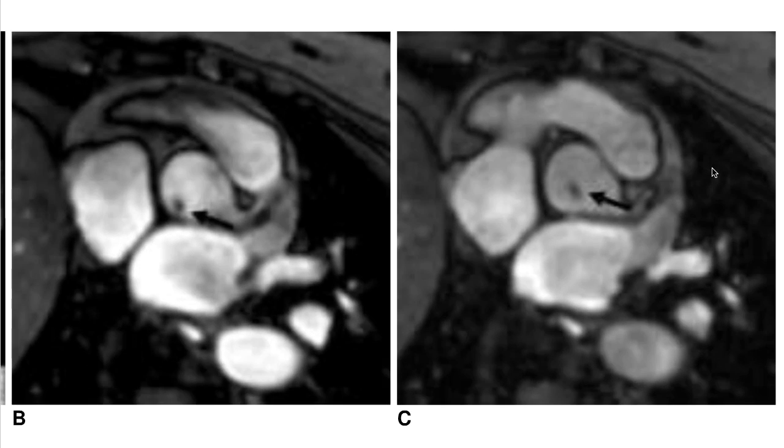Because of the relatively high water content and the presence of water in and around those fronds that's not moving in and out of plane, when we do our double inversion recovery images, our dark blood images, we're going to see bright signal of this mass. Some of that may be slow flow next to the mass. Here's an example of one.